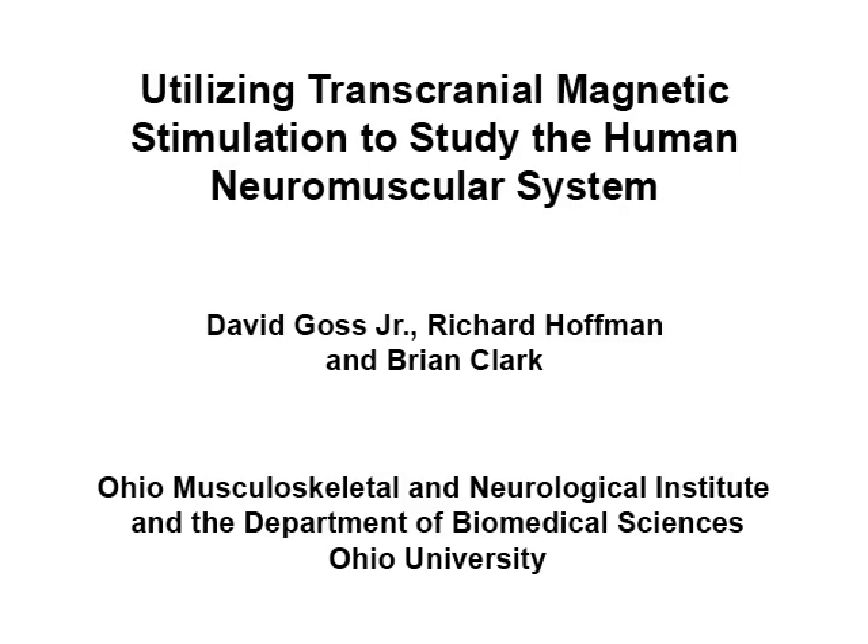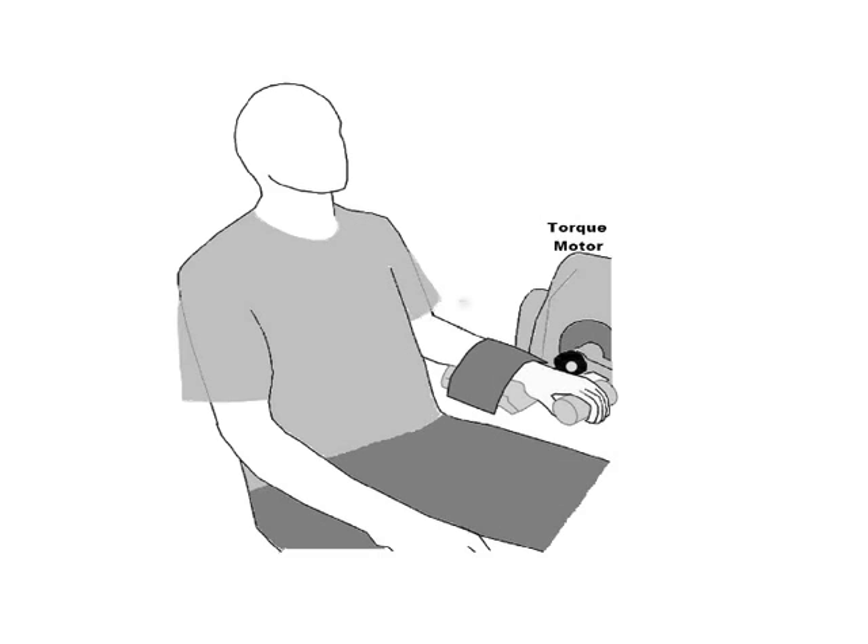The overall goal of this procedure is to perform transcranial magnetic stimulation to elicit motor evoked potentials, first in the flexor carpi radialis muscle and then in the erector spinae muscles. The hotspot is identified as the portion of the stimulation location over the motor cortex that elicits the largest motor evoked potentials.